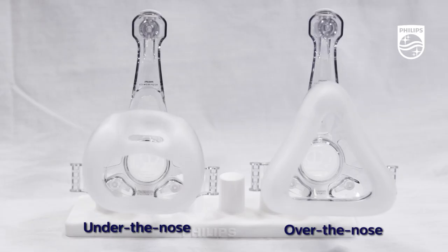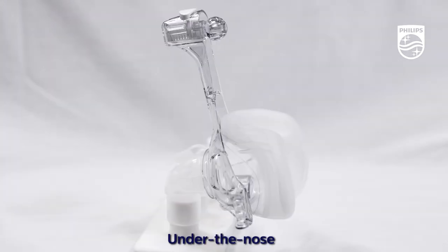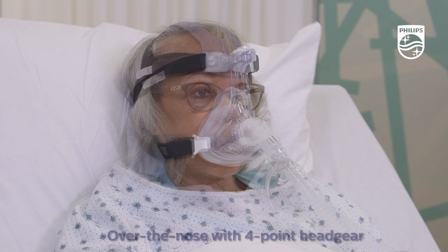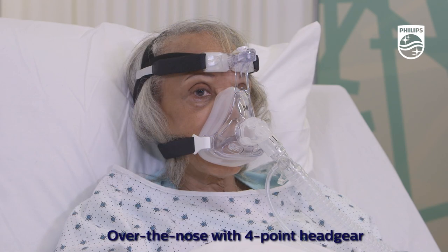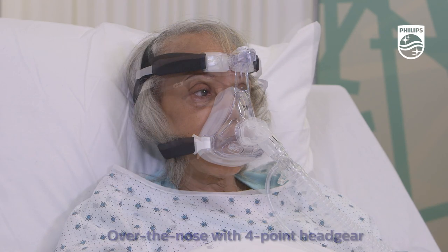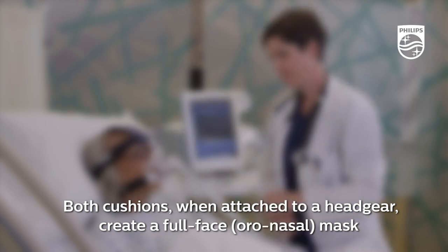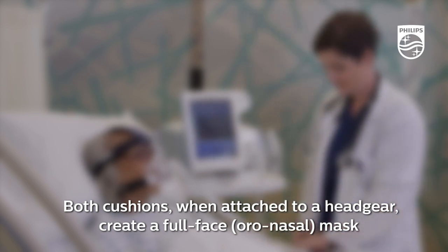The over-the-nose and under-the-nose cushions of the AF541 mask can be used on their own or interchangeably with a cap strap or four-point headgear. Even though one is positioned over the nose and one is positioned under the nose, both are considered full-face cushions, and when attached to a headgear, they create a full-face or oral nasal mask.